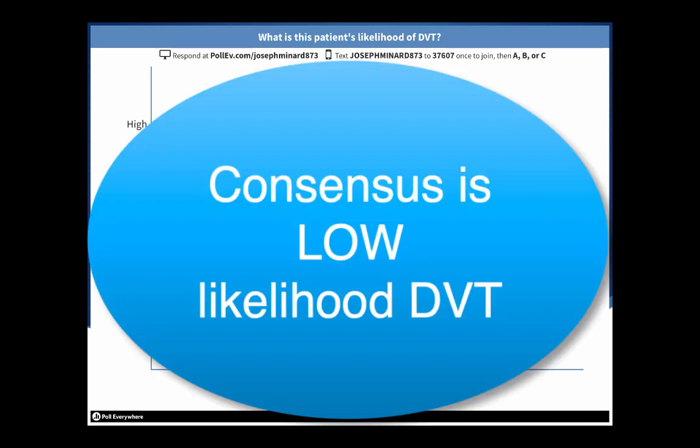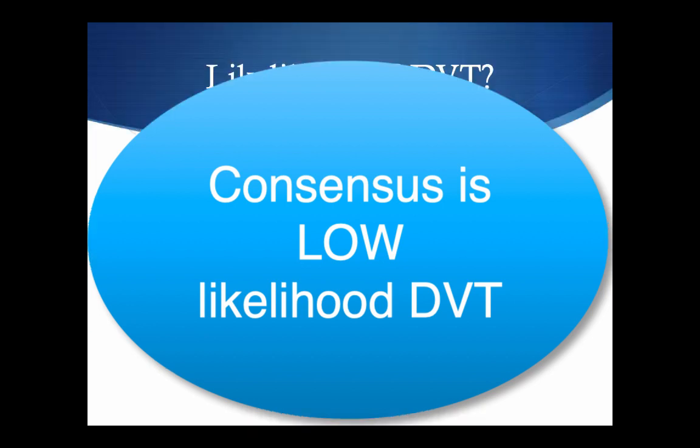So if you signed in, or you can just tell me, or you can pretend you're listening, what do you think is her likelihood of DVT? Low. Okay, low. All right, I heard low, we'll take consensus low.